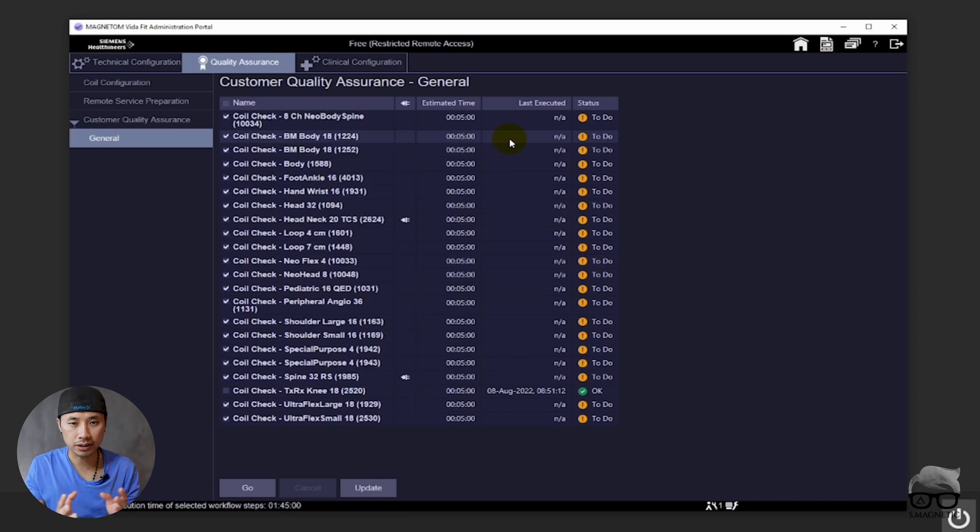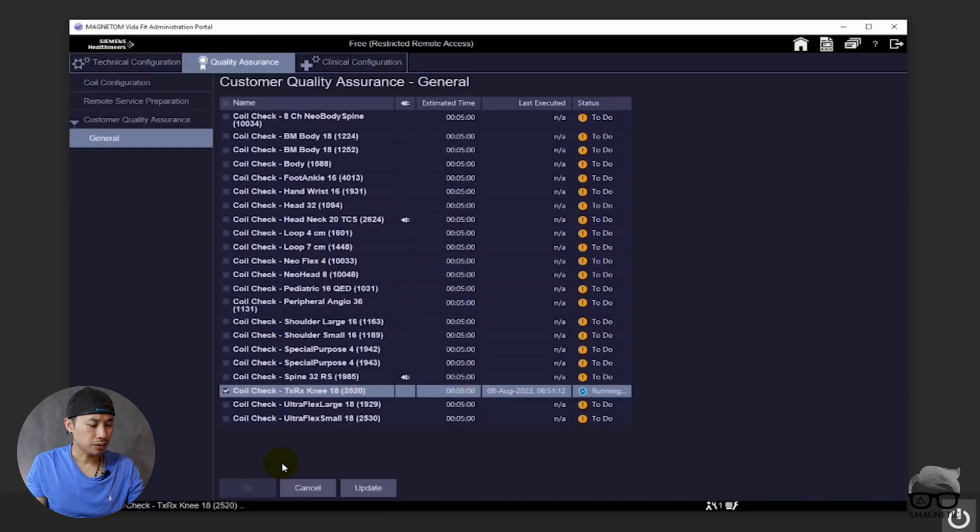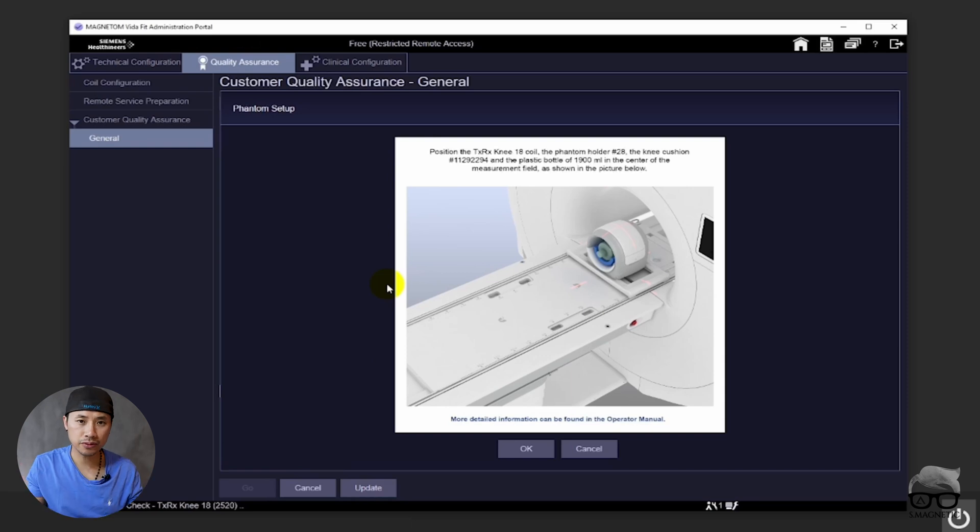One test could take two or three minutes — not that long. So we uncheck everything and we just want to do the knee coil to show you. You already plug in the knee coil, you check here and then you push the go button. A pop-up window appears like this, which explains very easily which coil to use, which specific phantom to use, how you should position the phantom, and how you should proceed. It's very easy.